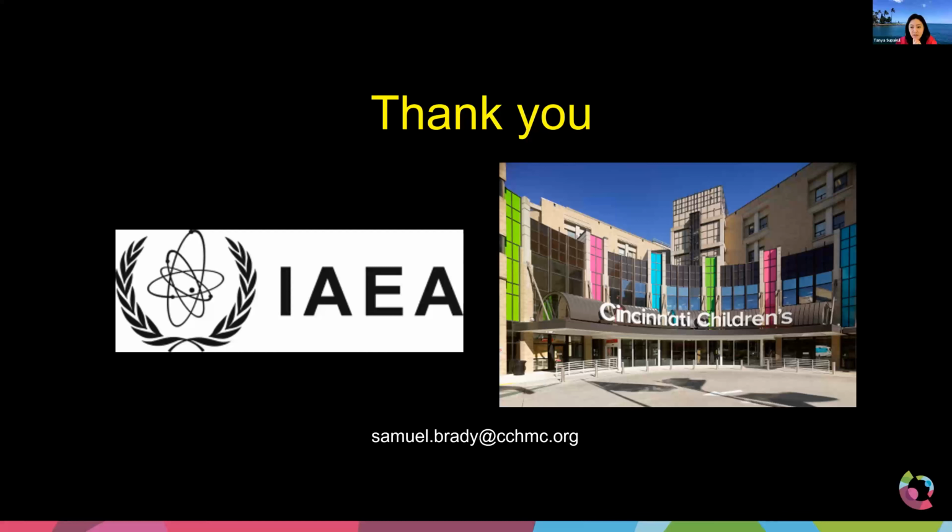Thank you so much, Sam, for giving us some aspect of the physics. How can we adjust the parameters on the kV and mA? And also, you mentioned we should take off the filter that we already have, because we have a filter in the environment, so we don't need a filter in the machine. So this is a good thing to know.